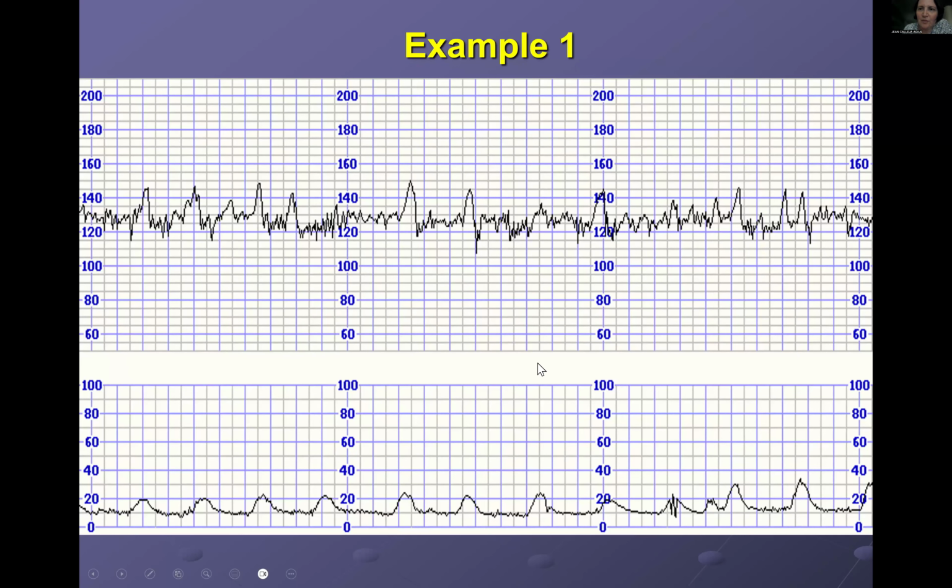Okay, so I would like one of you, I'm not going to be directing questions at anybody, not to put anyone on the hot seat, but I would like a volunteer, please, to go through the description of this trace, ideally using the DR C BRAVADO approach. So I'll be saying, DR, which is determine risk.